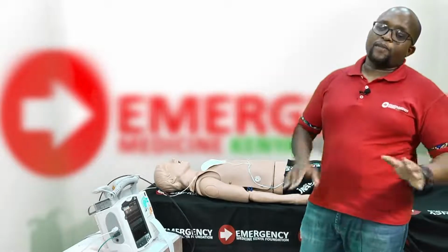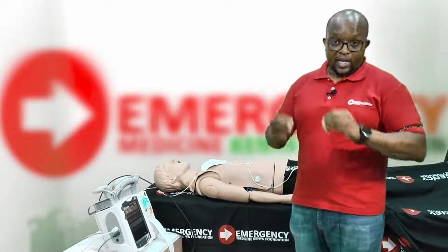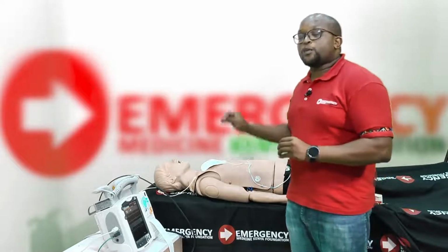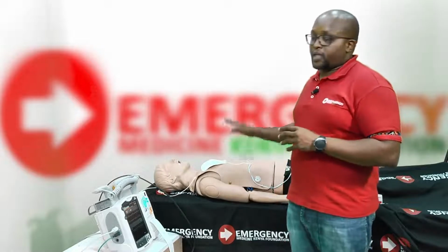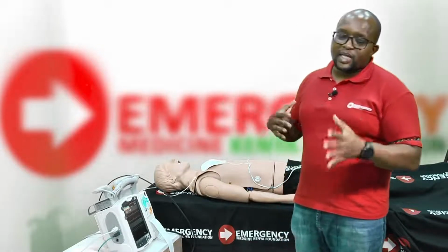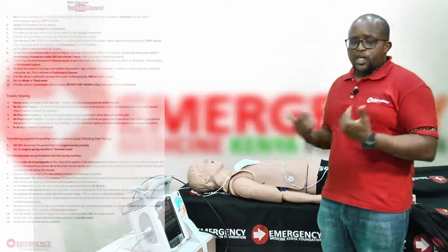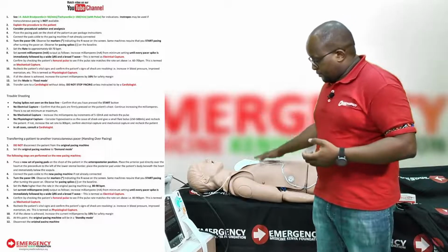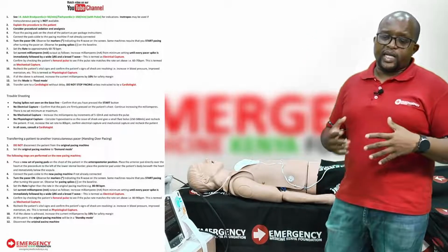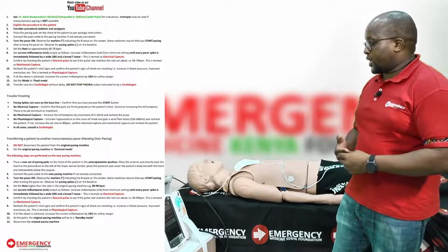Now, like cardioversion, in pacing your patient is awake and alive, and you're about to pass electricity through their heart. So you need to make sure you give them adequate analgesia and a bit of sedation, and explain the procedure to the patient, because it's quite a painful procedure and you want your patient to be able to tolerate the procedure initially. And once the patient's BP is up, then you can top up the analgesia and keep them comfortable.